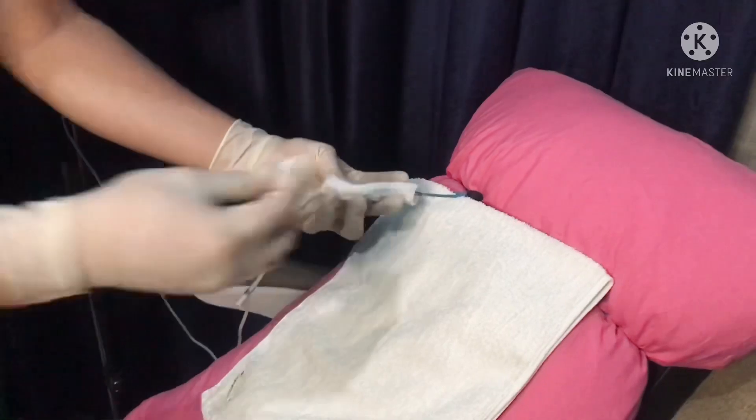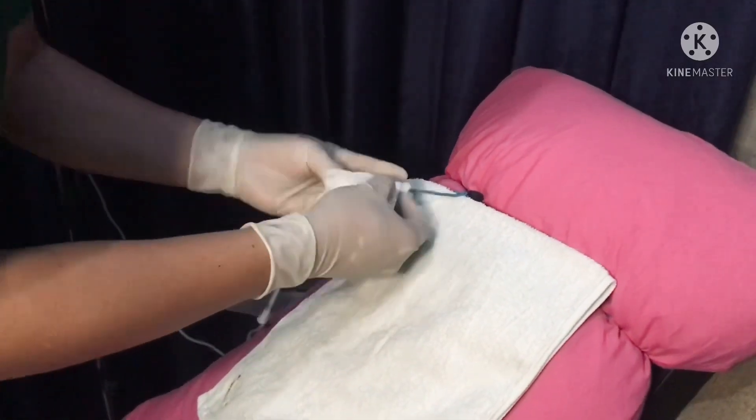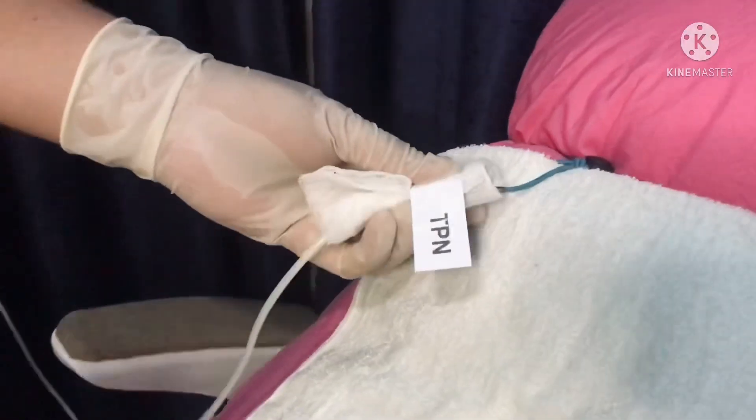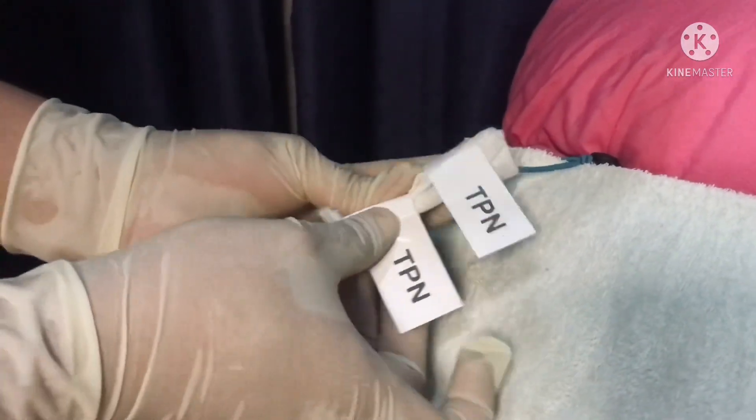Label the line using the TPN labels. Dispose of all waste, remove your gloves, and once again perform hand hygiene.